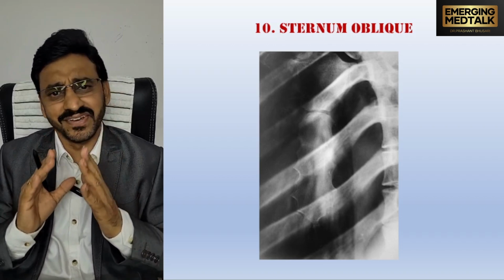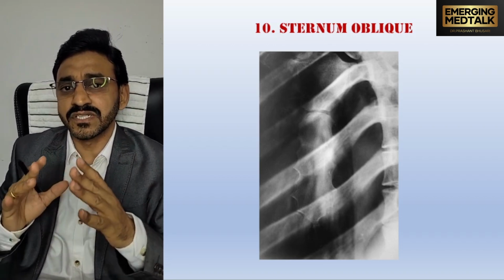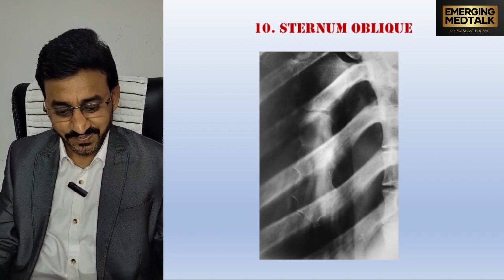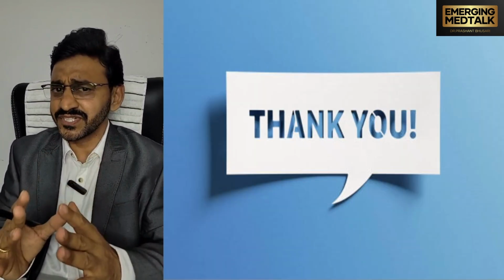So these are the very simple 10 views of the chest X-ray. Most common is the posterior anterior view. So this is all about today's discussion.